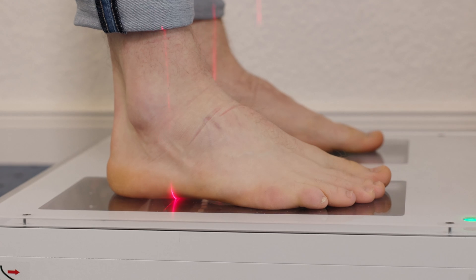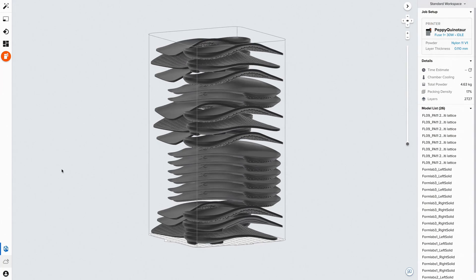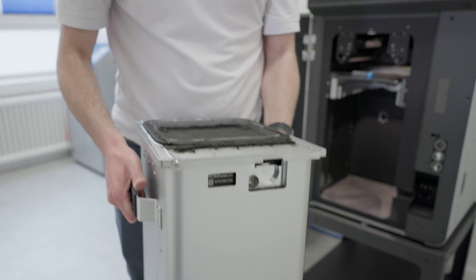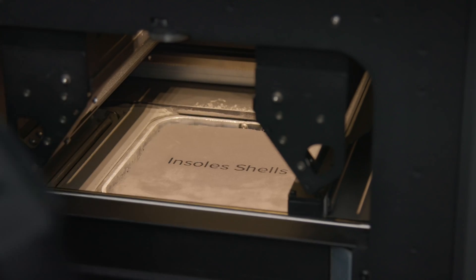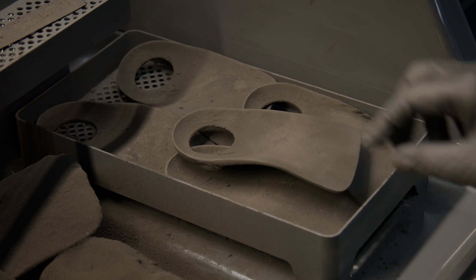Every orthotics and prosthetic lab should have access to the latest tools so they can put their best foot forward. Integrating 3D printing into your digital workflow provides a significant competitive advantage, allowing for the quick and accurate production of personalized insole shells. Although the cost of bringing 3D printing in-house has been challenging, Formlabs Healthcare is here to change that.